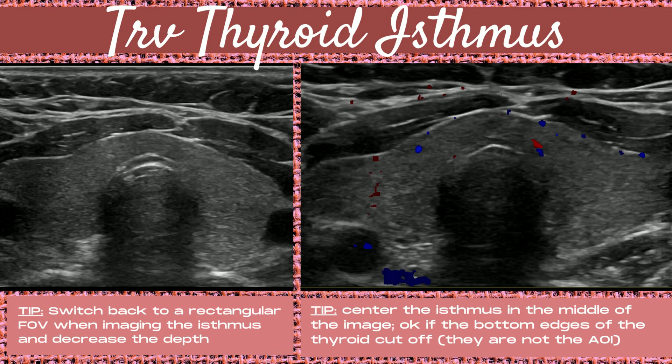Next, moving on to the transverse thyroid isthmus — this is the section of the thyroid that connects the lobes to one another. Switch back to a rectangular field of view when imaging the isthmus and also decrease your depth. Center the isthmus in the middle of the image. It's okay if the bottom edges of the thyroid are cut off, because the isthmus is now the area of interest — make that the star of your image.